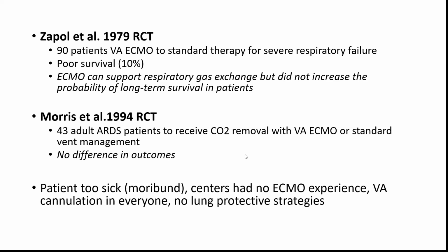But when we look back at these trials now from this vantage point, the patients in these trials were very sick. They had high disease illness severity. The centers that were enrolled in these trials, they didn't have any experience. So you started putting patients on ECMO with physicians that weren't used to managing ECMO patients. They put a VA cannulation in every single patient.